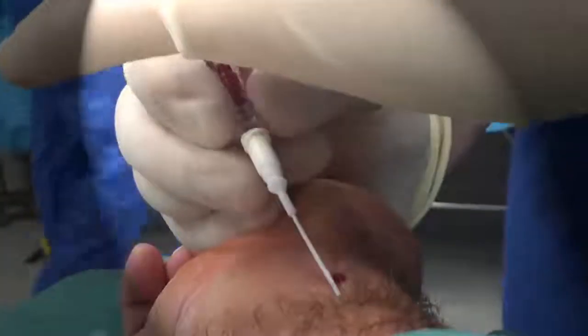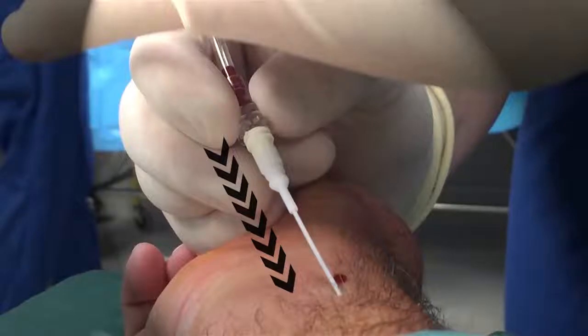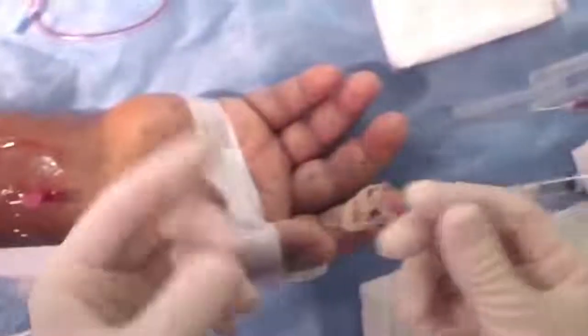Finally, if you are unable to thread the wire after multiple attempts, one common trick is to push the entire apparatus into the skin. The introducer will serve to push the catheter through the anterior and posterior wall of the artery. It is thus called the through and through method. You will need a separate straight guide wire for this technique.